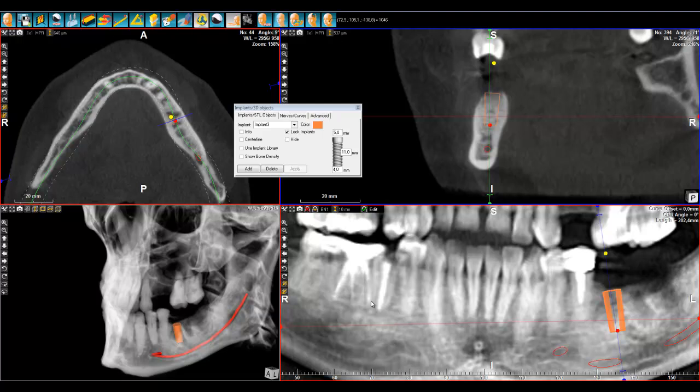Once you have placed an implant, like I just did in the last chapter, there is a very nice way to check if the bone density is going to be okay for the stability of the implant.